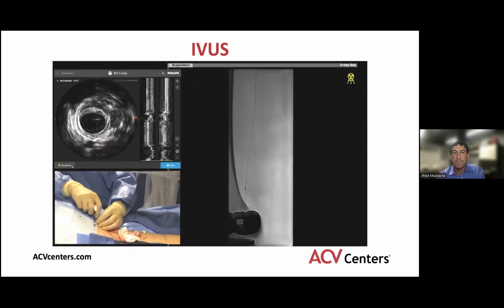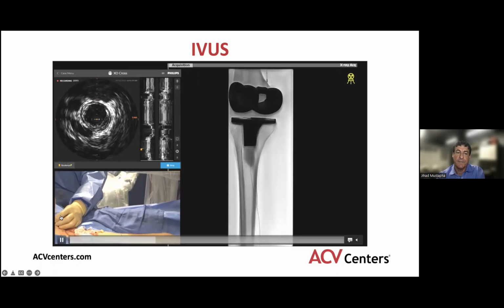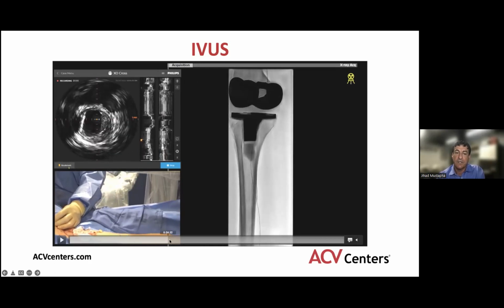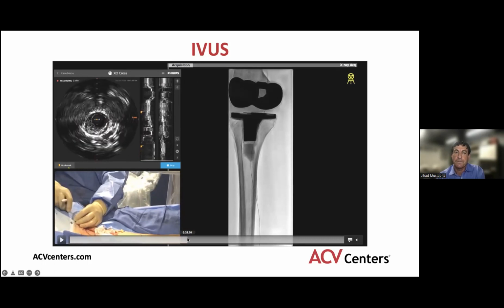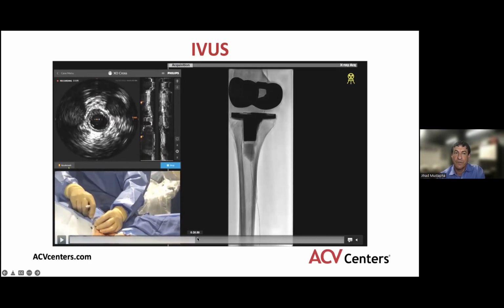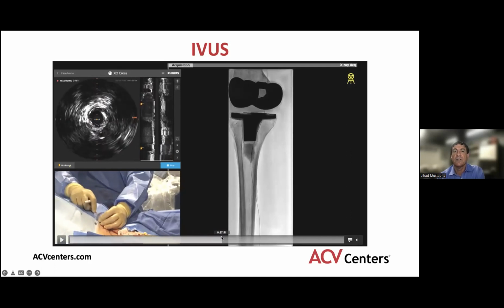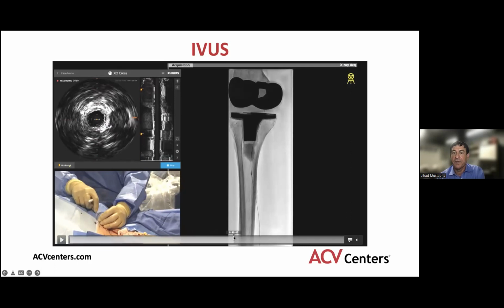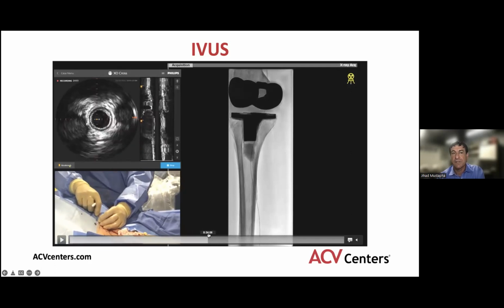This is an area in the popliteal artery. Remember, we did not balloon anything distally. So this is probably one of the issues that this patient is dealing with, and that is a plaque rupture with embolization, which left a spontaneous dissection in the popliteal artery area. Now, this is the P3 segment of the popliteal, which looks reasonably healthy. So we don't have to address this at this point.